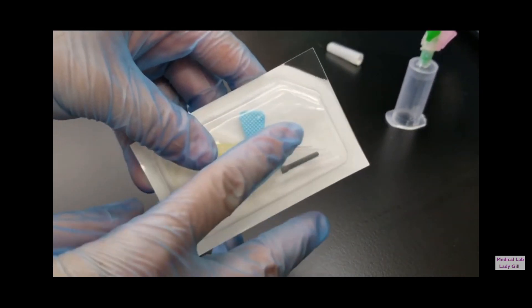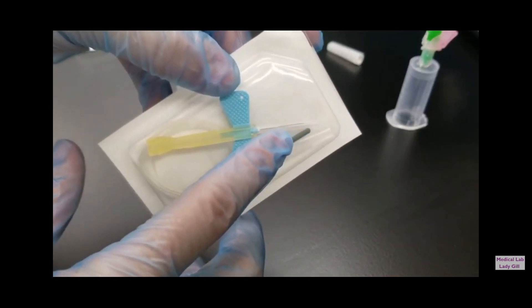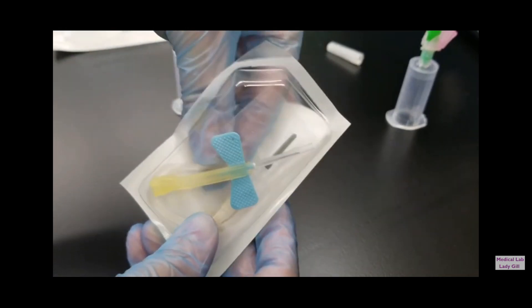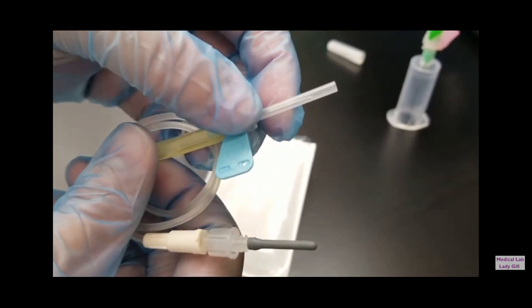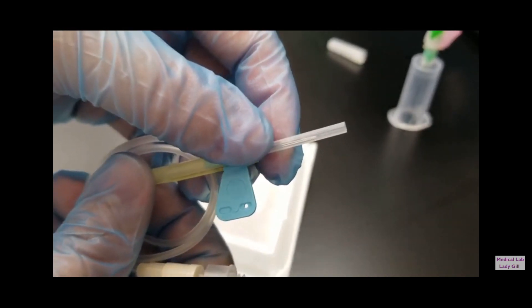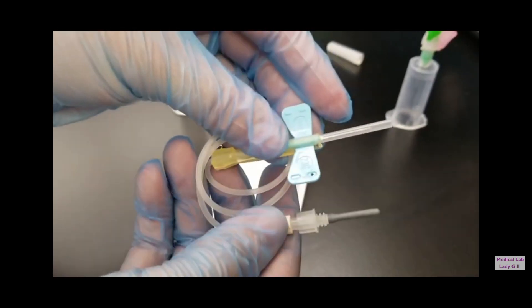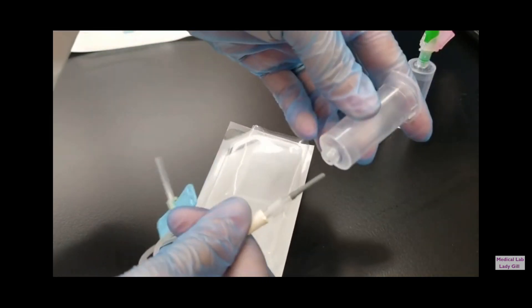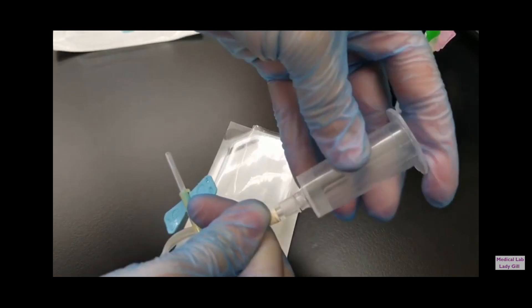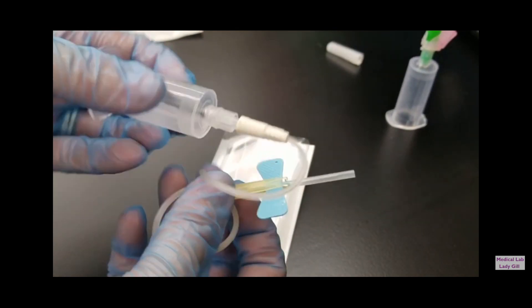To make sure that everything is sterile, you have to disinfect your hands, wear your gloves, and make sure not to touch the needle. Inspect the needle for any discrepancy — no tip, no bevel, and no jagged edges. Inspect the needle but never remove the cap. Once you're done inspecting, get the evacuated tube system adapter and insert the rubber sleeve over needle and lock it using the lure interlocking cap.